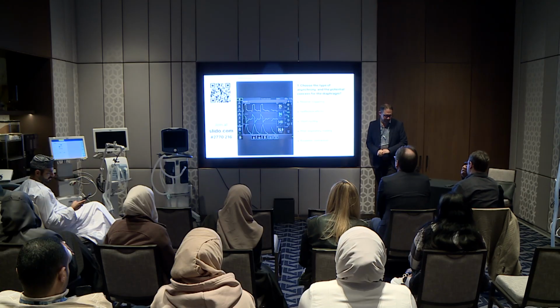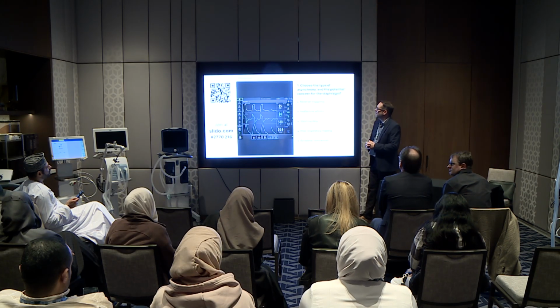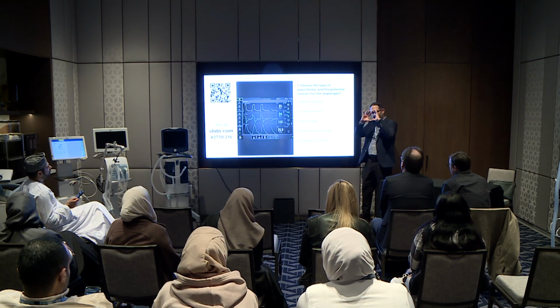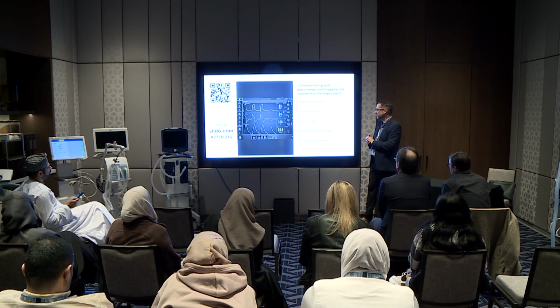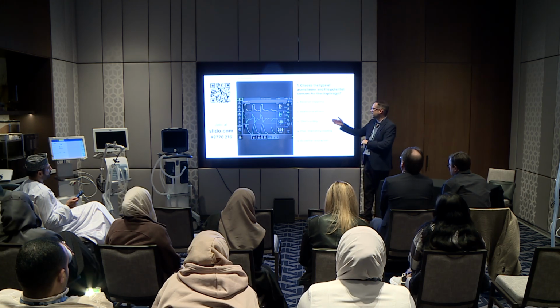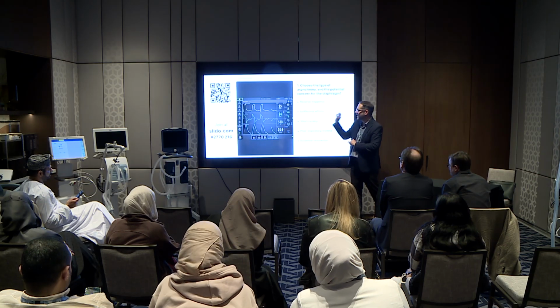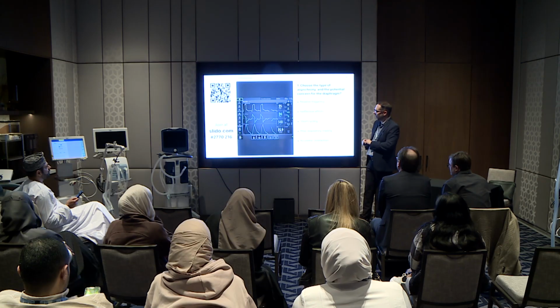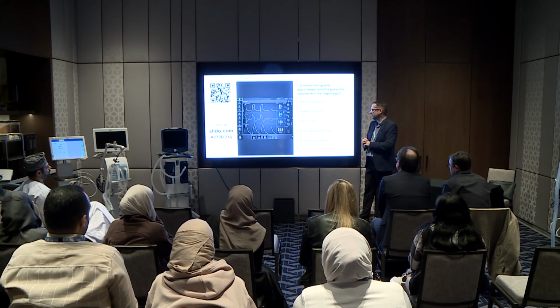The last few questions here are a little bit more combining. There are only 3 questions and then we are done. Choose the type of asynchrony and the potential concern for the diaphragm. So this is just thinking a little bit outside the box. I had mentioned a few things like eccentric contractions. I mentioned post-inspiratory loading. Of course, we have mentioned the types of asynchrony. There is one type of asynchrony occurring here that I want you to select, and whether or not you think it's post-inspiratory loading or eccentric contraction.